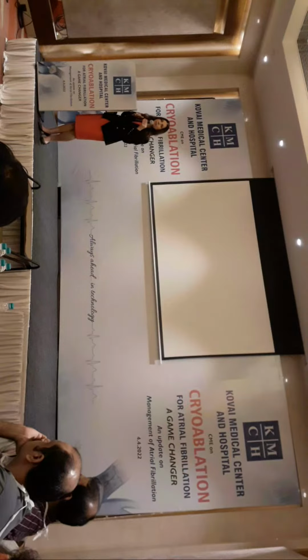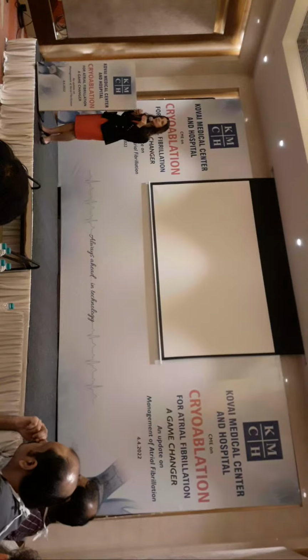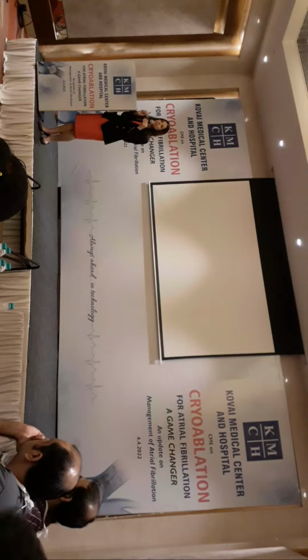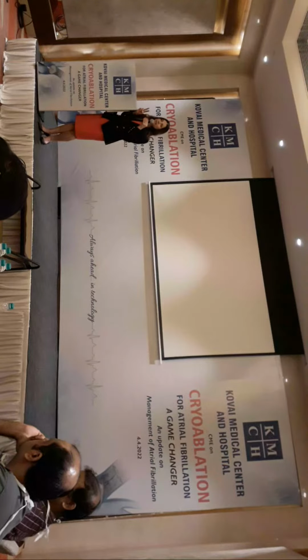And so we're recommending this as a first-line treatment for people who've had 1 or more episodes of atrial fib. And again, the results are much better with small left atria, not a lot of comorbidities. So yeah, we're out there recommending it.